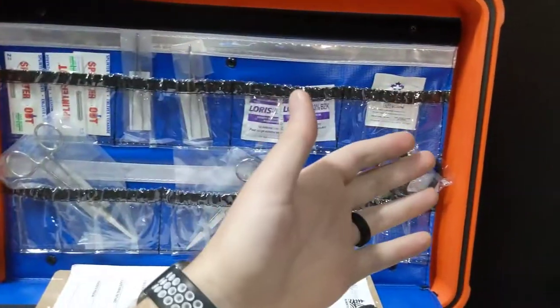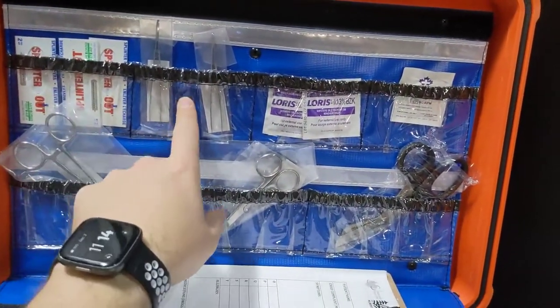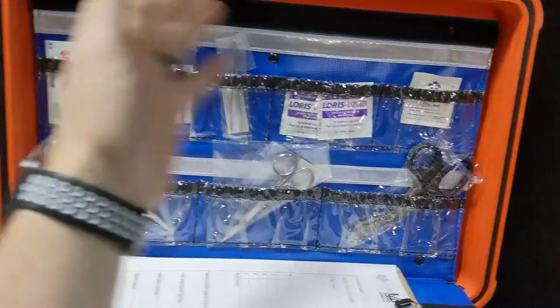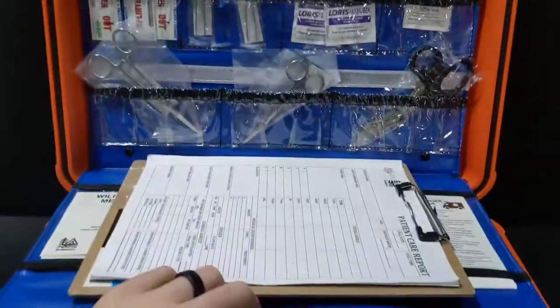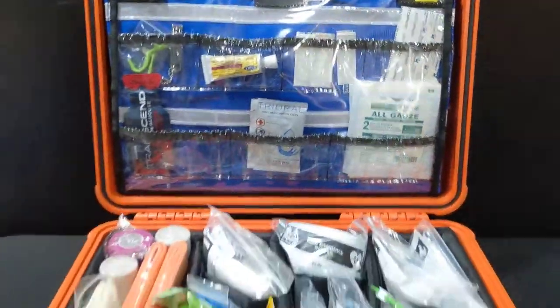There's another back layer of organization set up for instruments like splinter tools and tweezers, cleaning swabs, alcohol swabs, scissors, and Kelly clamps. You can set this up however you like and label all those areas. When you're done, you simply fold it up and it holds itself closed with Velcro.